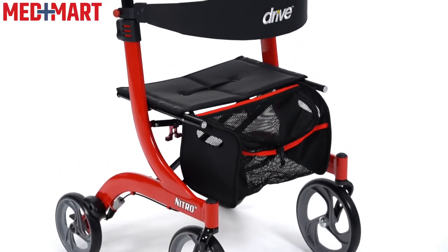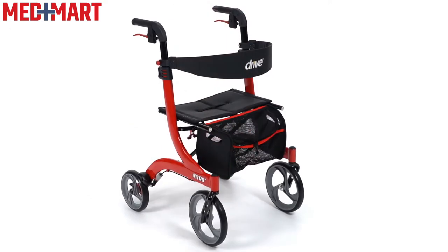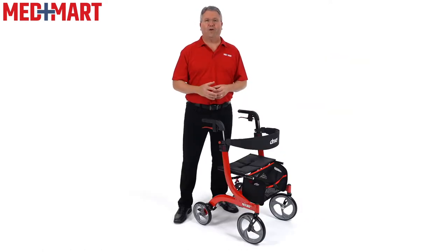Are you looking for a rollator with a unique sharp design that's also durable and lightweight? The Drive Nitro Euro-Style Rollator is an excellent option, and it could be perfect for your day-to-day mobility needs. My name is Jeff, I'm a product expert here at MedMart, and I've been a registered nurse for over 25 years.